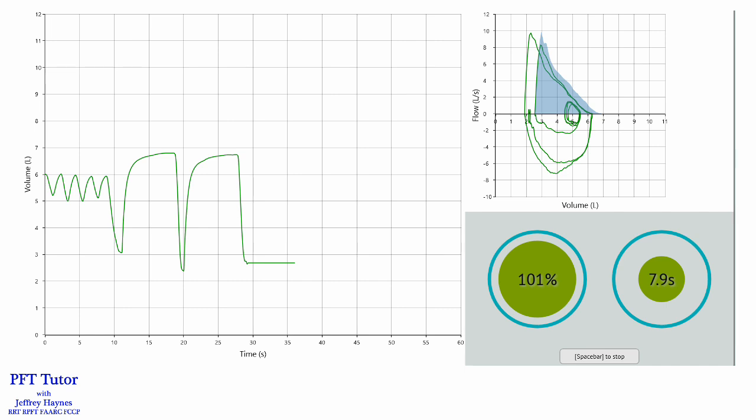The other thing you can try to correct a submaximal inhalation error is just have the patient do a second forced expiratory maneuver. So as you can see here, I have the patient doing tidal breathing. They take a full breath in, blow all the way out. The second time they take a full breath in, it exceeds the inspired volume from the first one. So I just have them do it again. Forcefully exhale again. And then when they're empty the second time, and you see they take an inspired volume, they are much closer together. And you can see the differences in the flow volume loops.